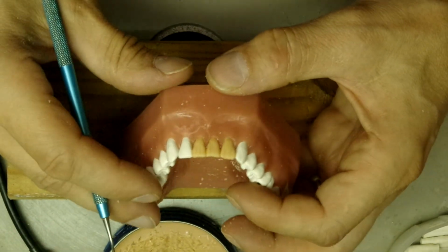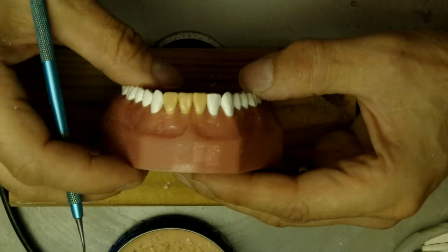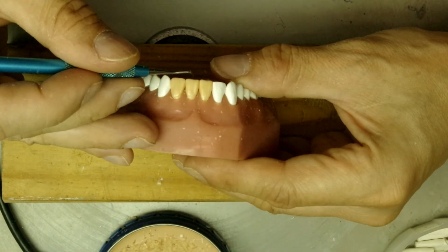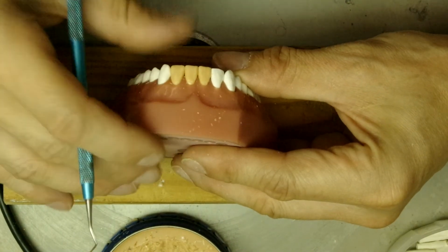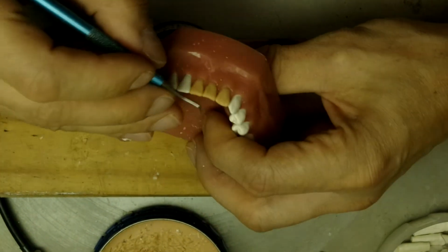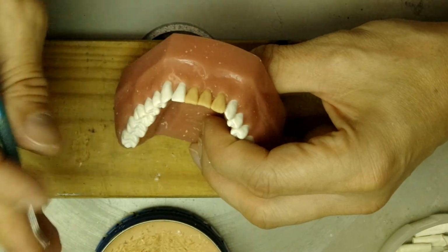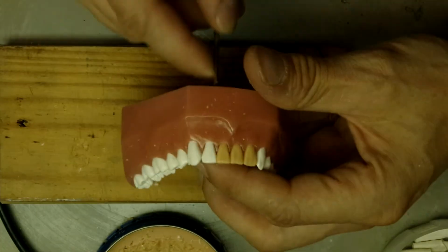I think that's pretty good. I have a little bit of an irregularity on the incisals of these, but I think that looks good. It doesn't have to be perfect. Remember, perfection sometimes makes teeth look fake. So let's go on and we'll do the lateral incisor on the left side, which is tooth number 23.